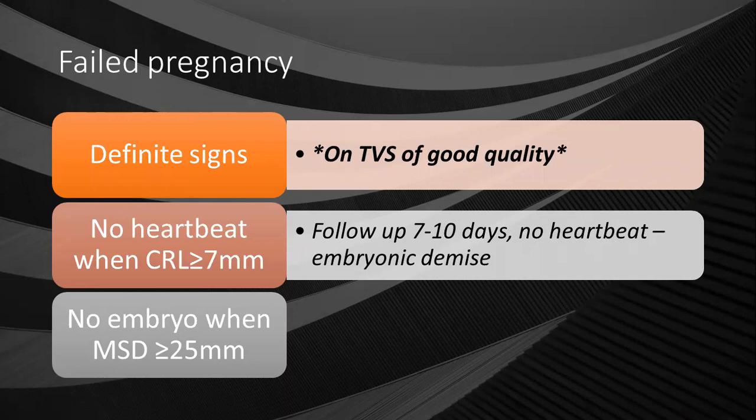So we cannot definitely make that diagnosis. We sort of have a gray zone when we are looking at these cutoff values, because as long as we haven't reached that cutoff value, it's difficult for us to make a definitive diagnosis.